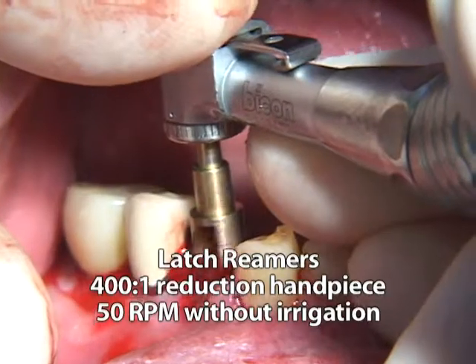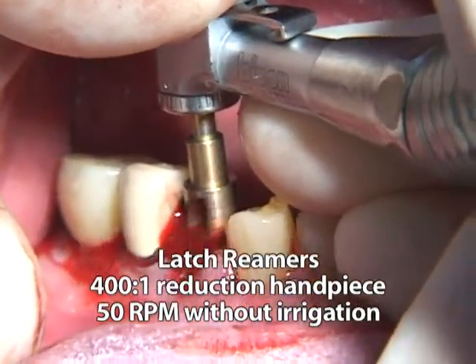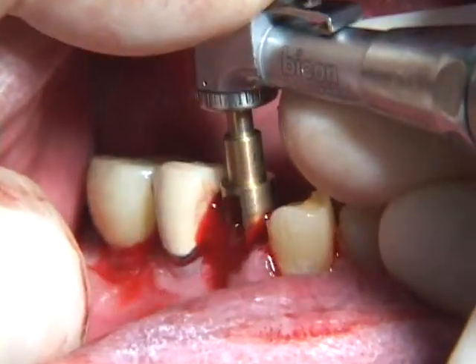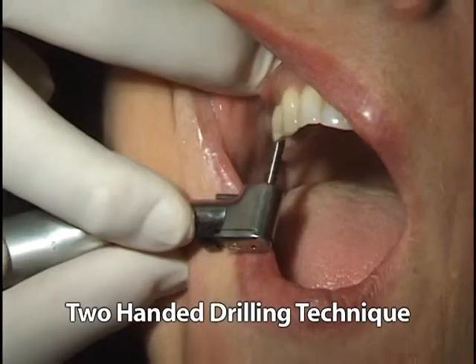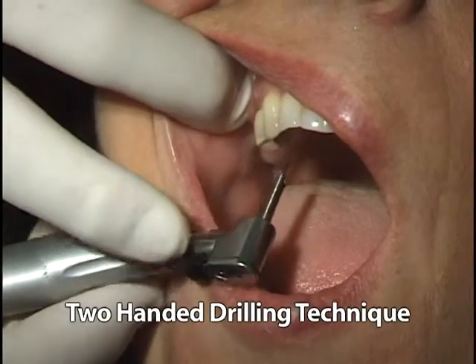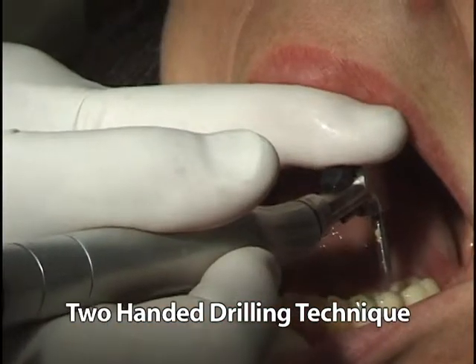The latch reamers are best used in a two-handed drilling technique. While one hand guides the trajectory of the drilling, the other hand applies the apical inserting and coronal withdrawal force.